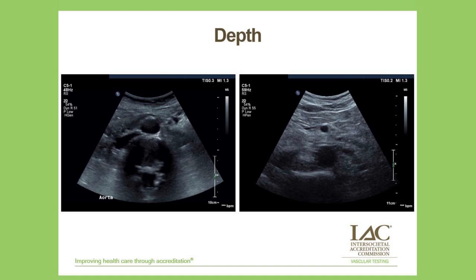You want to get the smallest depth of field to image your area of interest, and then a larger depth of field for deeper structures.